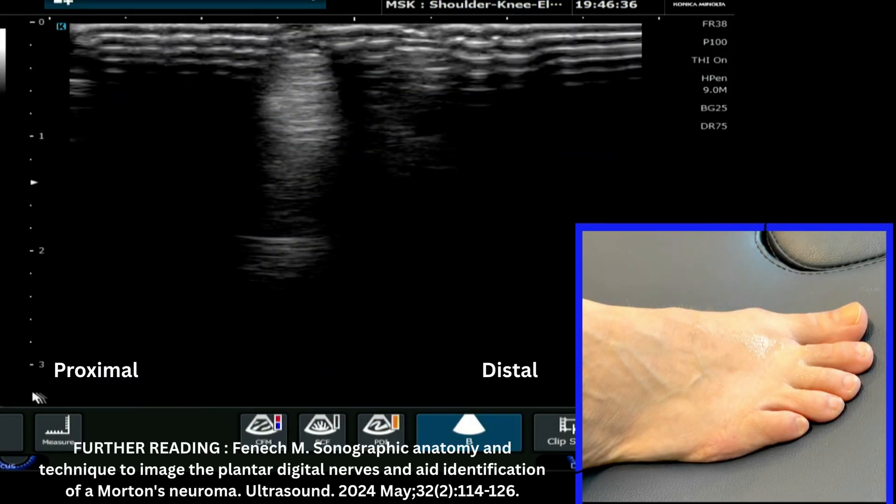We're now going to look at how to evaluate a Morton's neuroma bursal complex on ultrasound. We're going to approach this as a series of videos looking at different views, which will hopefully give you the best way to perform these scans of the webspace region. To start with, we're going to look at a basic dorsal view of the webspace, specifically the third-fourth webspace, which is the most commonly affected area for this condition.